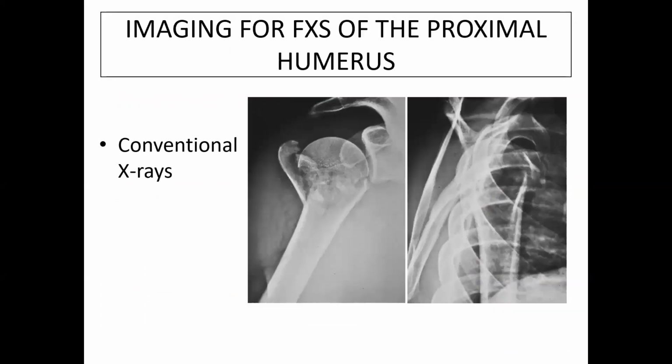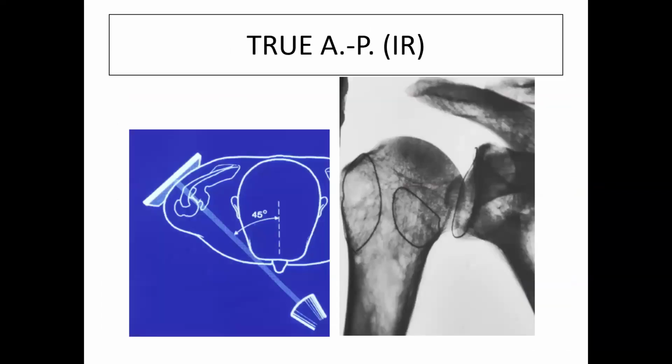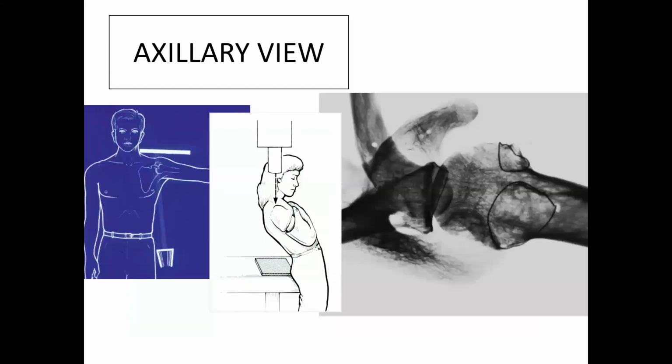As regards the imaging, we used to do conventional X-rays, of course, in AP and lateral, and we do a true AP to show us the lesser and greater tuberosity. And it's difficult to do the routine axillary view because the patient, of course, cannot abduct the shoulder. So we move to the Velpeau axillary view, as you can see in the picture, with the female patient in the sling.